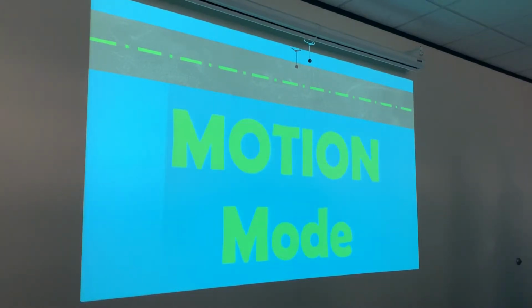What was the x-axis? The x-axis was the time or depth. In both A and B mode, the x-axis is the same thing: the time or depth, time of flight or depth. In A mode, amplitude mode, the y-axis represents the amplitude. In B mode, the z-axis represents the amplitude.